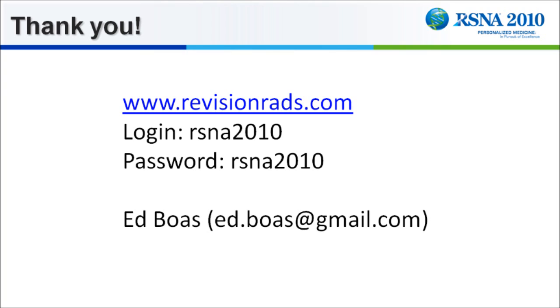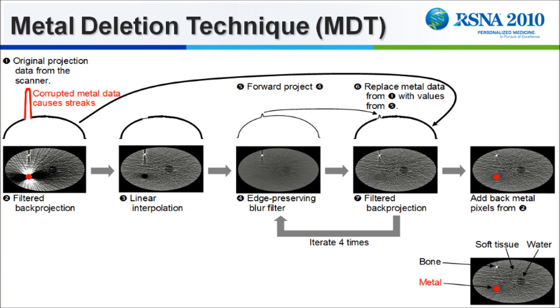Thank you very much. If you're interested, the final 2 slides cover the technical details of MDT. We start with the projection data from the scanner, which is shown here for a single X-ray tube position. We then generate the FBP image, which is shown here.